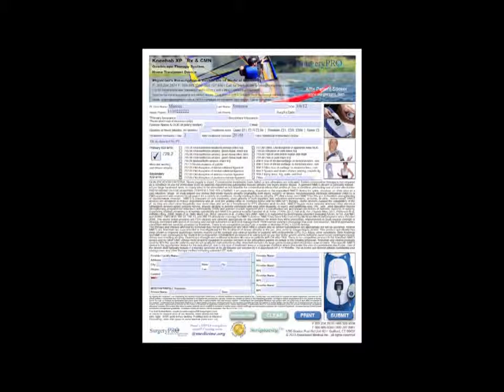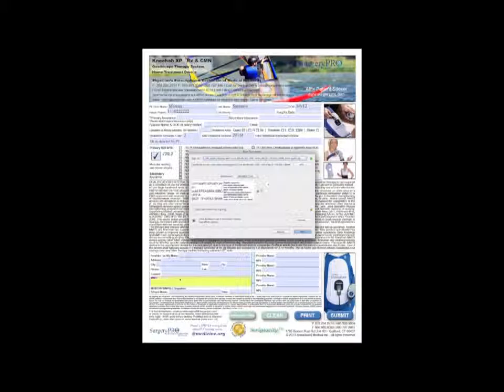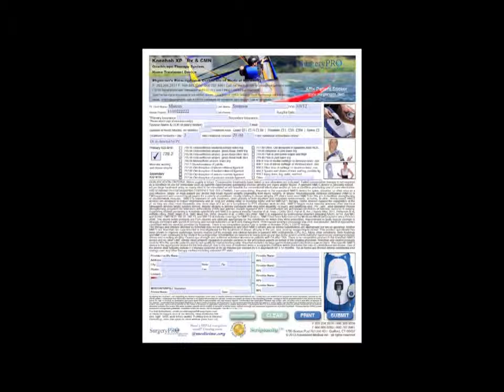So working backwards, when I click the signature field, this is my digital signature, but I can have a drop-down list here of different digital signatures, and I can label them appropriately. That would allow me to have all of my doctors that might prescribe this set up electronically, and as long as I have their permission and it's their signature and I'm acting on their behalf, then I can assign that Dr. Smith has prescribed this, and obviously that's part of his protocol. That's doable. Or if I'm the doctor and I have this in my laptop, no problem.